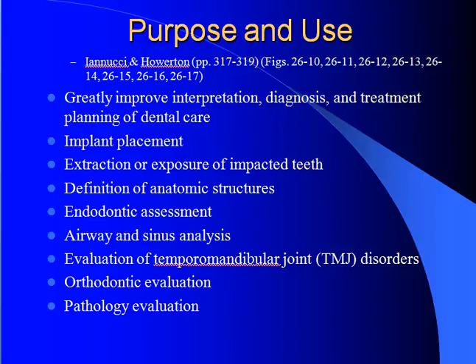CT scans greatly improve interpretation, diagnosis, and treatment planning of dental care. They are very valuable in implant placement, treatment planning, extraction or exposure of impacted teeth, definition of anatomic structures, endodontic assessment, airway and sinus analysis, evaluation of TMJ disorders, orthodontic evaluation, and pathology evaluation.